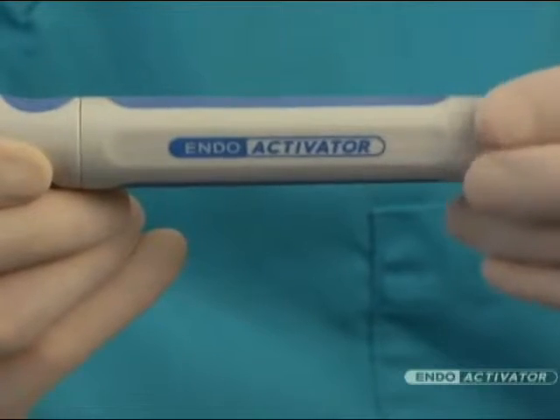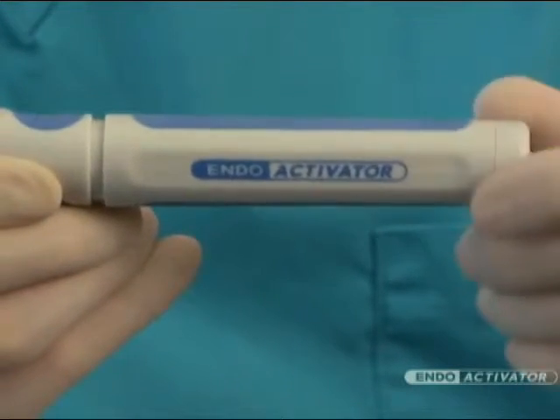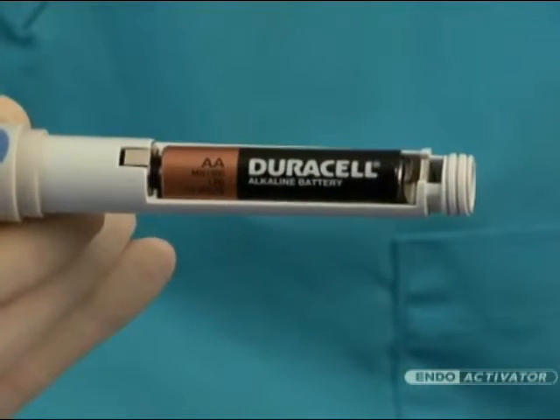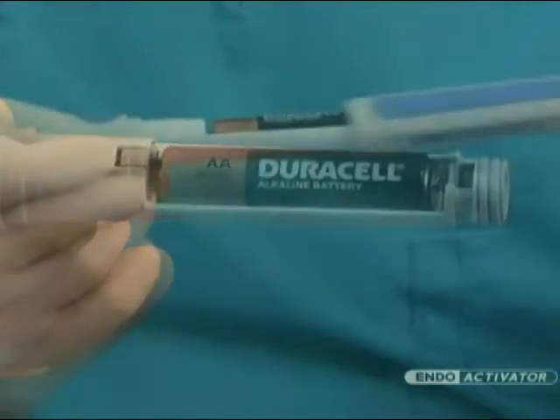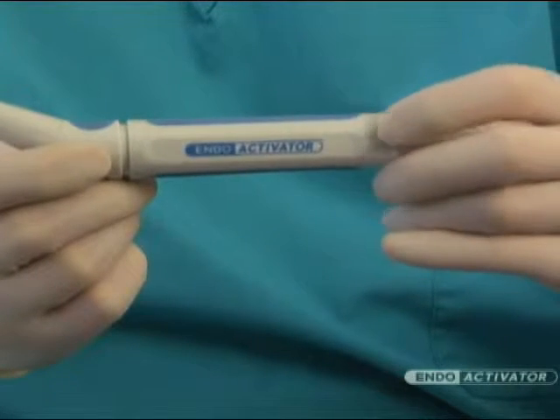To access the battery compartment, simply turn the non-removable screw cap counterclockwise to remove the housing. Remove the battery and replace with a premium-quality AA alkaline or lithium battery. Depending on use, periodically install a new, fully-charged battery to ensure optimal performance.